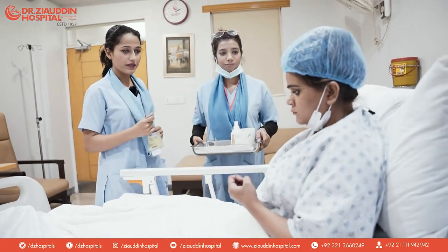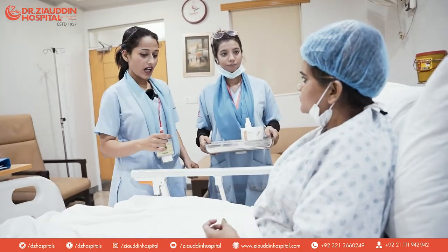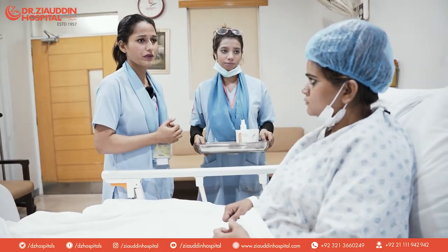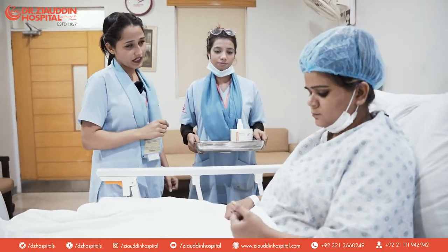Let's do the patient's cannula. Hello, Assalamu alaikum Sabah. In your right hand, it was swelling and redness, so we removed it. Now you have to do the new cannula.